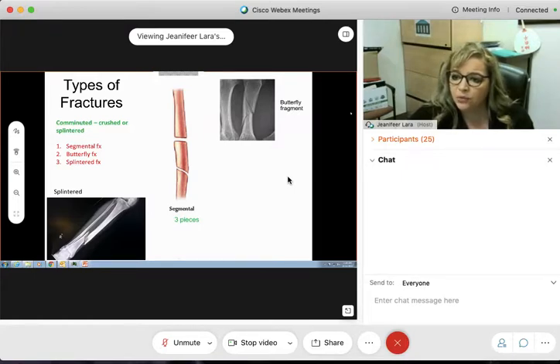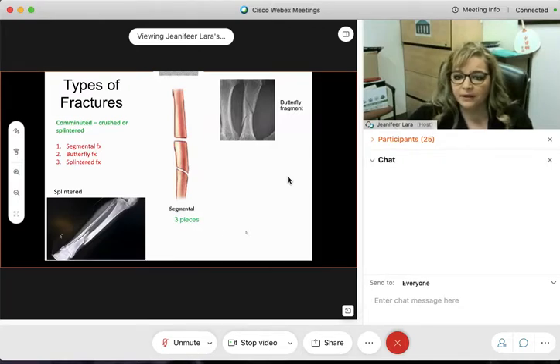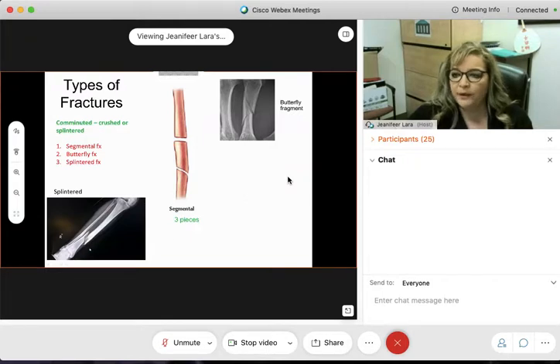Got it? You could cause more trauma by trying to move this patient as opposed to working around the patient. Make sense? It's not about being easy for you. It's about doing what's right for the patient. Make sense? So just keep that in mind before you start rotating your patient into a true AP and lateral.